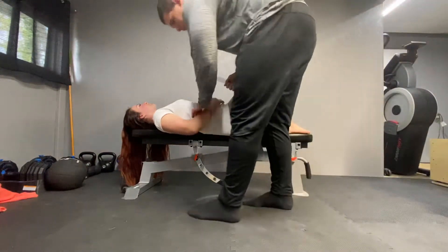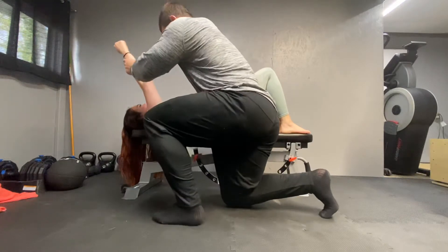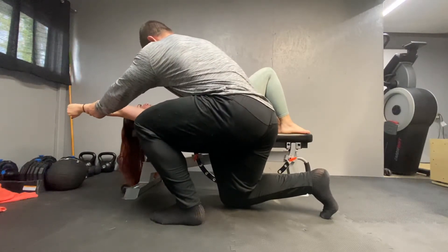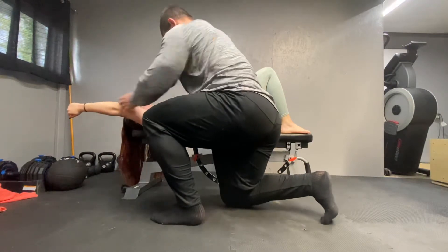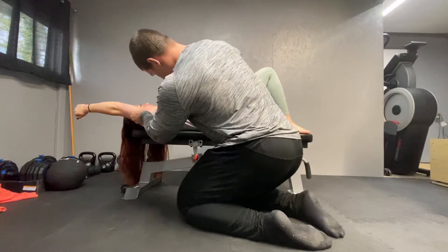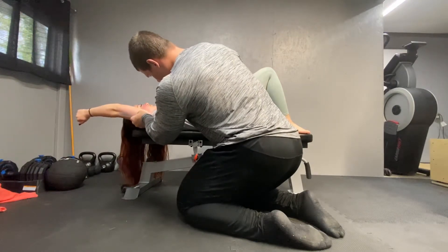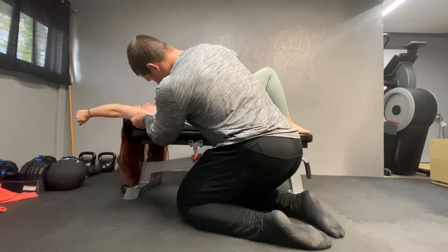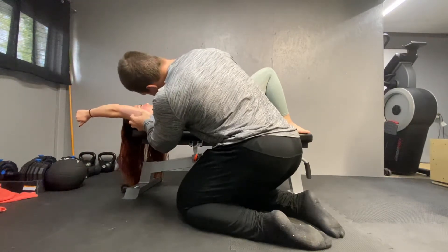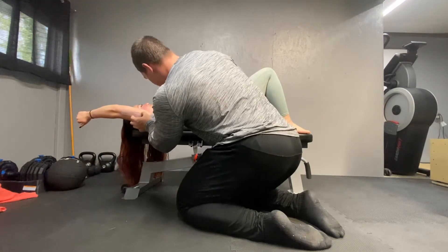Alright, so right here, flex that — there. Hold that. I'm reading the long end middle black numbers, and we have about 161 there. That's good.